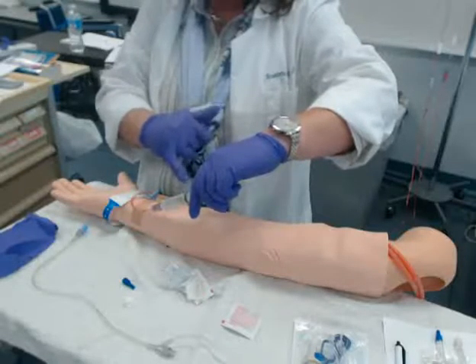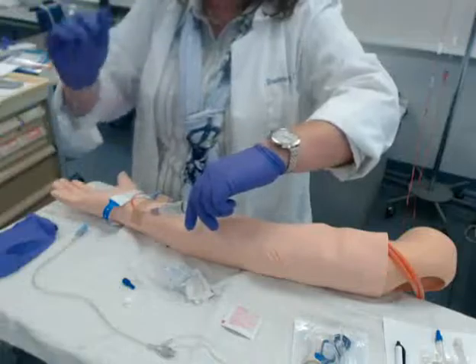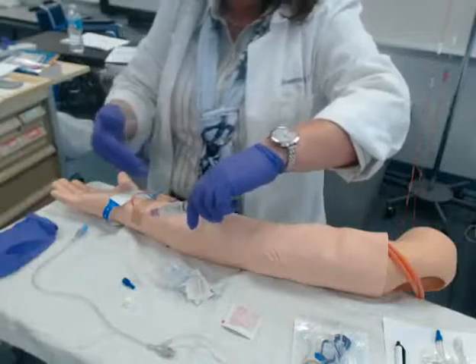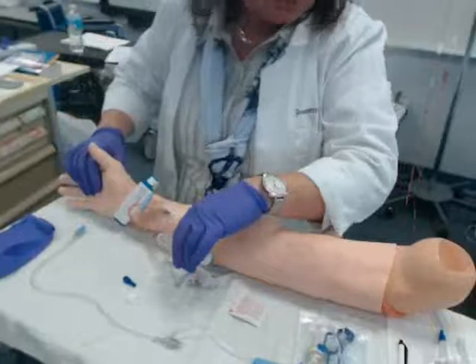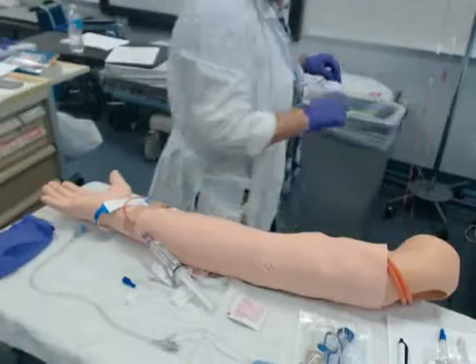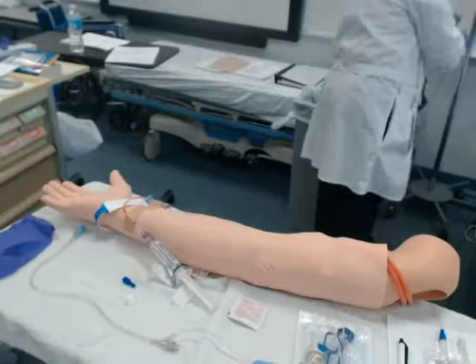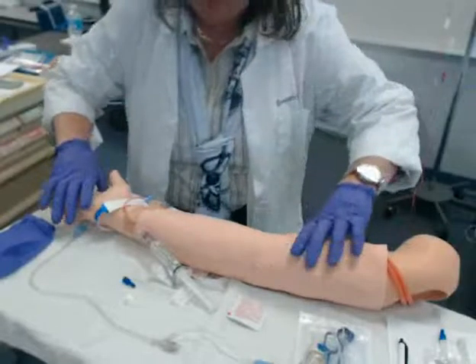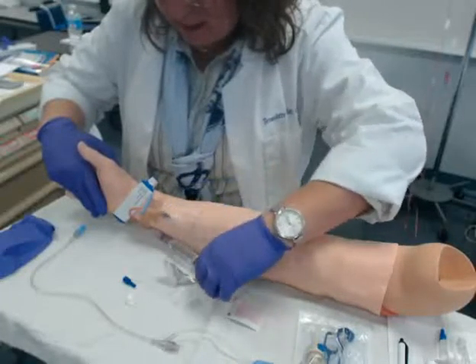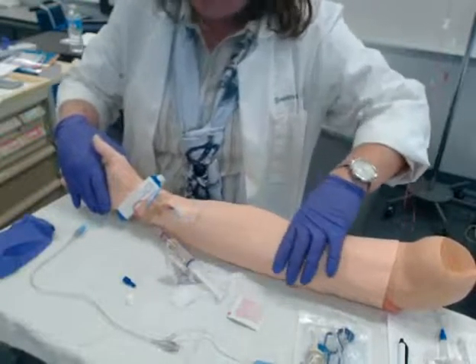I'm taking my cap off. I'm putting it cap side up because I'm going to use it again. Make sure there's no air. There's a valve in there — you have to push it in and twist. My saline is still locked — my extension tubing — so I'm going to unclamp it. If I push and get resistance, it's because my clamp is still clamped. Now I would give it a little aspirate just like you did with IM. I'm going to aspirate my tubing back and look for a flashback. I don't want to fill my tubing up with blood because all of these steps decrease the risk of infection, since this is an automatic access to our patient's bloodstream.